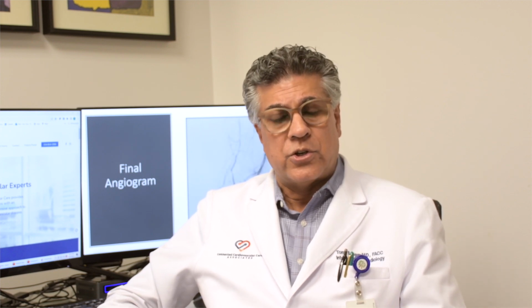You don't feel too much pain or discomfort because as the catheters go in, you really won't feel them. We inject contrast dye through the catheters, which allows us to see the arteries and the veins in your body. We also measure pressures in your heart and we can assess whether or not there's any significant blockage that may or may not need to be fixed. We'll make that assessment at the time of the procedure, and we will frequently proceed with doing the diagnostic pictures and the fixing of the arteries with stents, balloons, and other catheters that we have at our disposal at the same time to try to avoid more than one procedure.